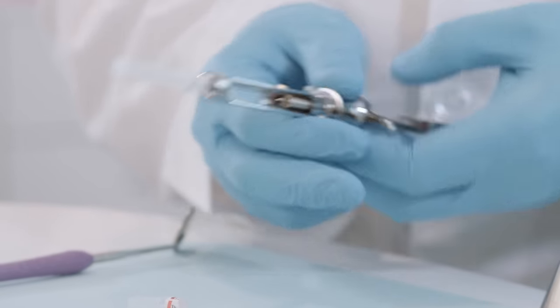You can alleviate the pain associated with palatal injections by applying pressure for at least 30 seconds with a cotton-tipped applicator. You may find it difficult to inject local anesthetic because of the close adaptation of the tissue to the bone. Hitting bone and backing up is important so that the periosteum is not damaged. Greater palatine nerve blocks are indicated for pain management of palatal soft and osseous tissues distal to the canine in one quadrant. For right-handed operators on the right side, sit at the 8 or 9 o'clock position; for the left side, the 11 o'clock position. A left-handed clinician may sit at the 3 or 4 o'clock position for the right side or the 1 o'clock position for the left side.